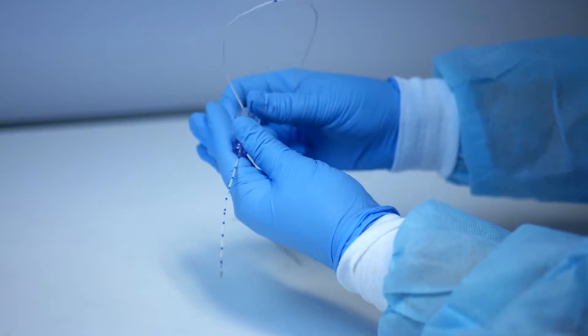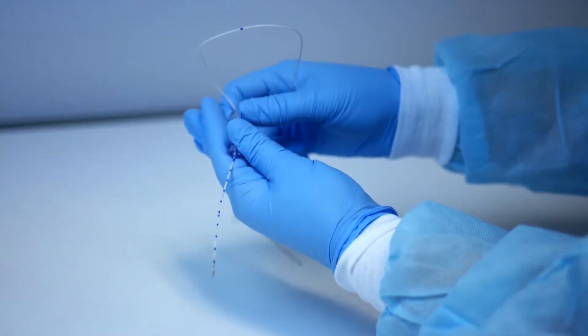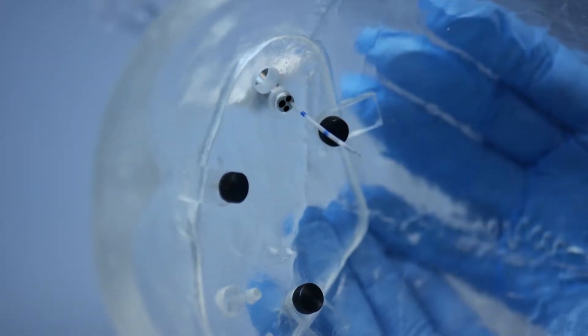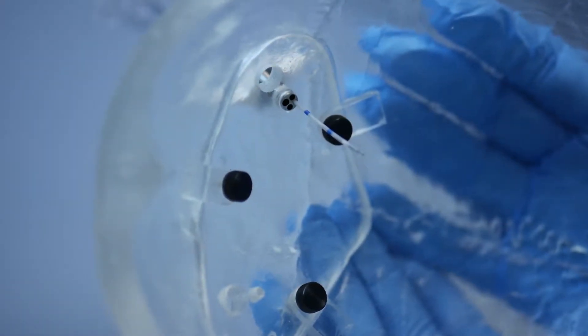This preloading technique ensures the perfusion probe is placed at the ideal depth between 2.5 and 3 cm below the dura. Set the preloaded assembly aside.